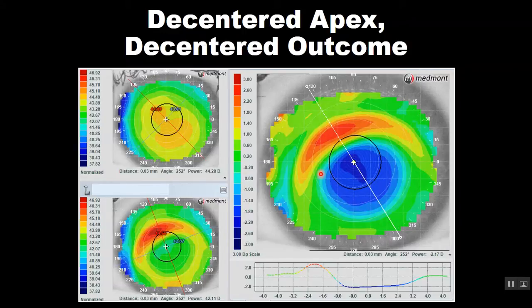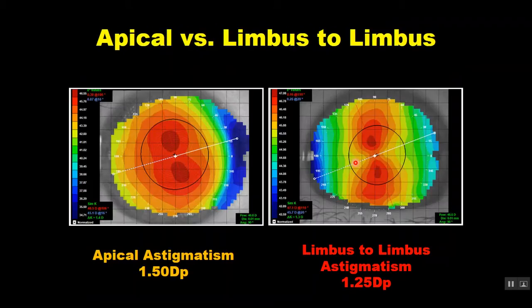So this might be as good as it gets for this patient. If this doesn't provide quality enough vision, then it may be this is the best that we can do for this patient. We would, of course, try to loosen up the landing zone or alignment zone of the lens, try to bring it up a little bit, so loosen it up since it's riding a little bit low. But if that doesn't do anything, then we know we're simply fighting nature.